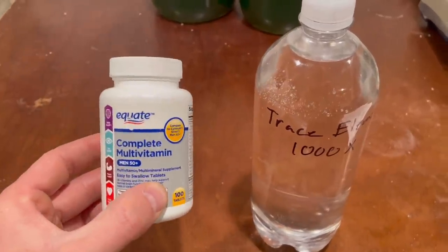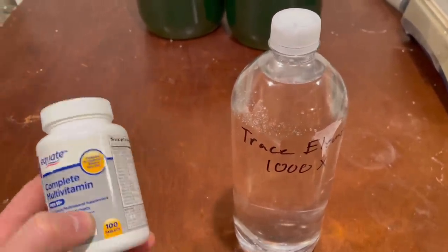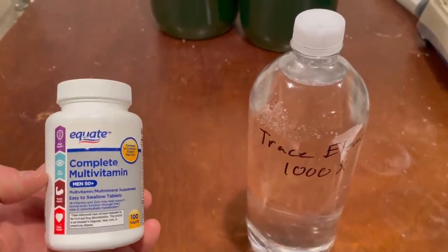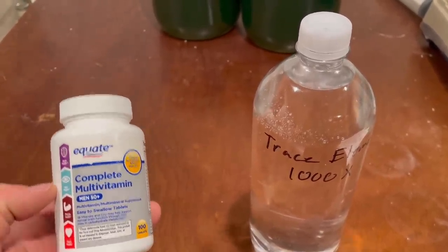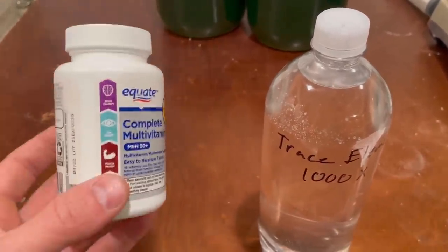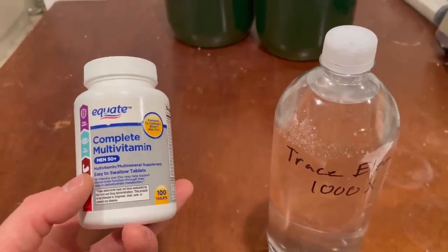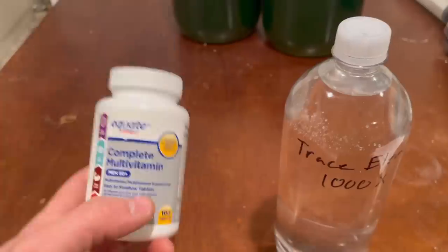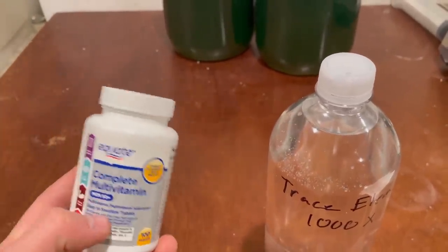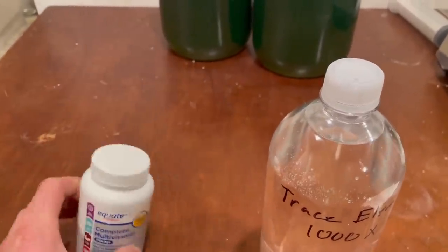A note on using multivitamins instead of pure trace element compounds: multivitamins contain a lot of binders and essentially sugars that greatly increase the chances of growing mold or unwanted bacteria. It's not ideal — I'd avoid it if possible — but I have used them and it does work. You just have to take a little more precaution keeping everything clean and making sure to sterilize everything.